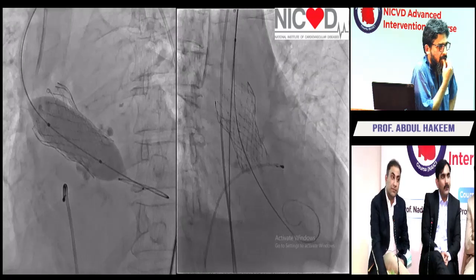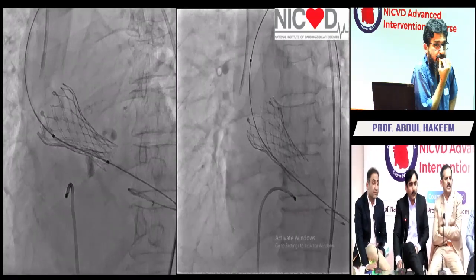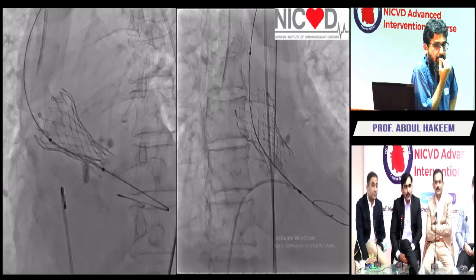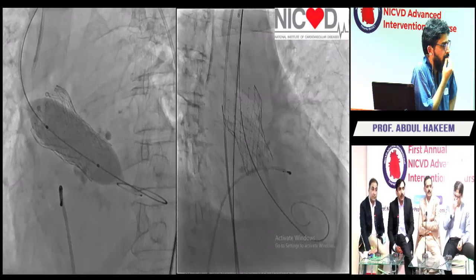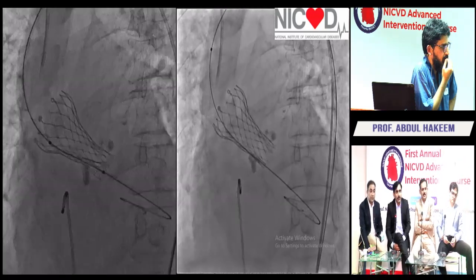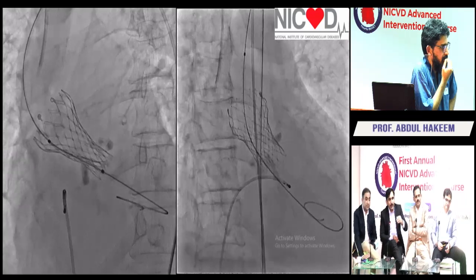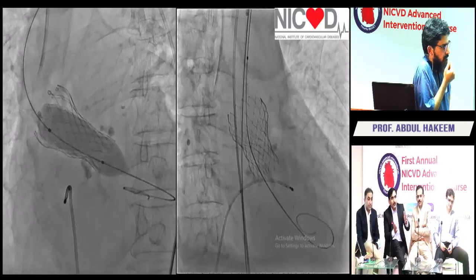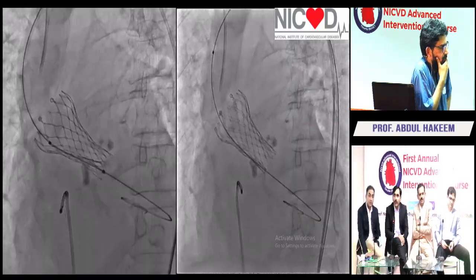It was very slow. I think you have to speak a little louder. Because mostly the coronary flow occurs in the diastolic phase. If a valve is embolized into the aorta and you put another valve at the position, there's little diastolic filling in this area. So chances are coronary perfusion will be affected.